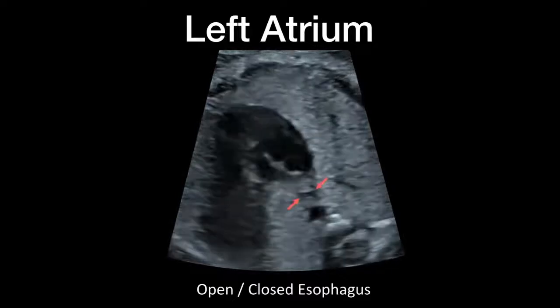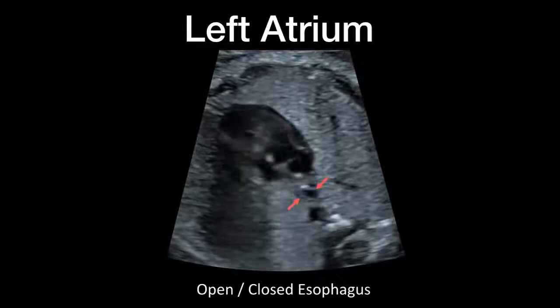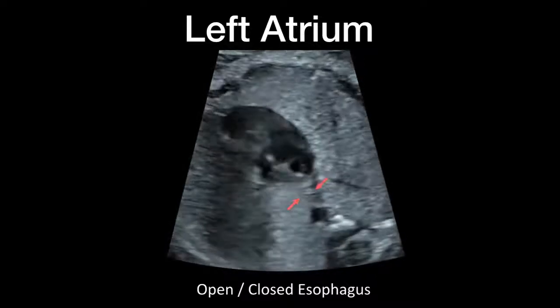So if you monitor just long enough, you will know that this is the esophagus, and this is not a collector vein, for instance, sitting there in an anomalous venous return. Very, very important structure, keep in mind.